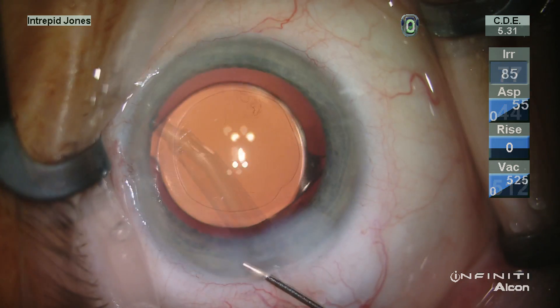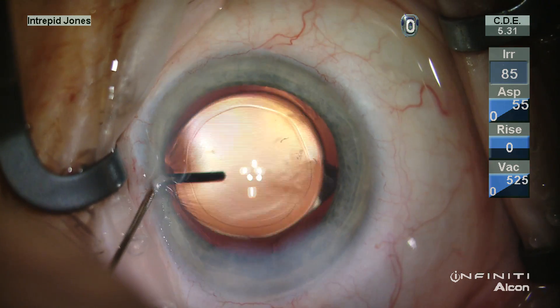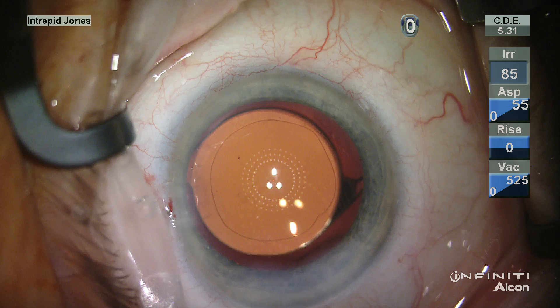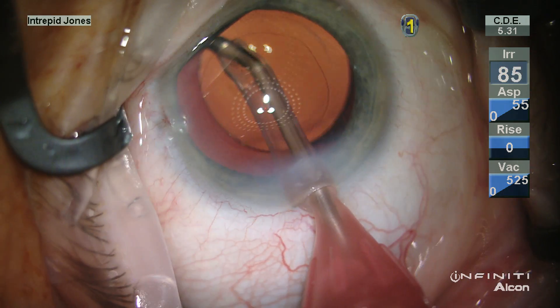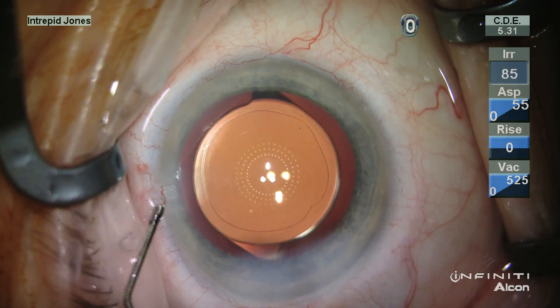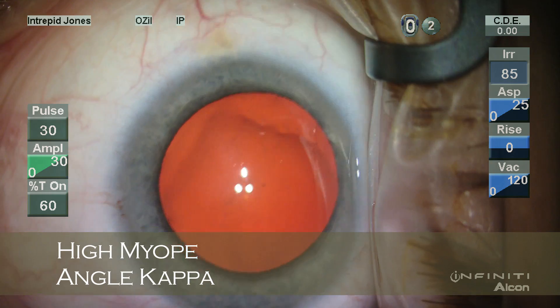In this case, once the lens is in place and the viscoelastic is removed, it's noticed here as the anterior chamber is inflated that this lens does not really want to center that well. By rotating the lens into a more central configuration, we obtain excellent centration and this is confirmed with the keratoscope.